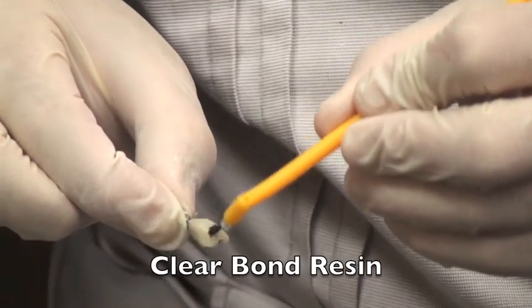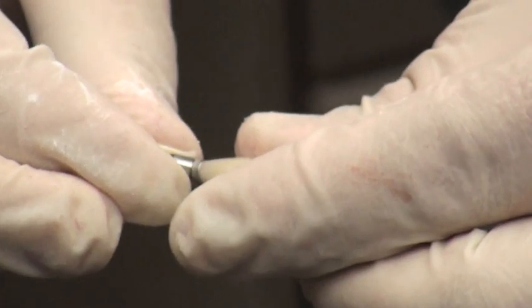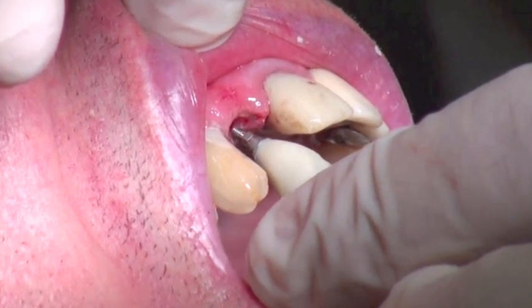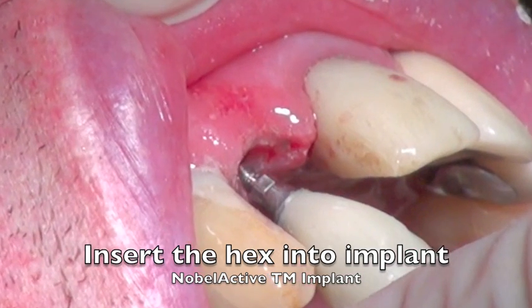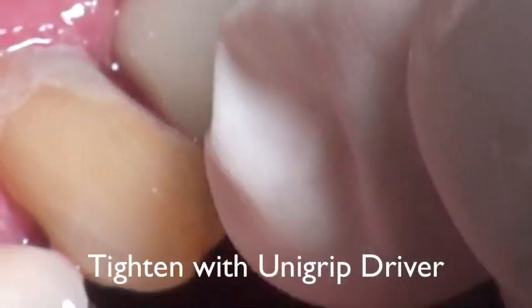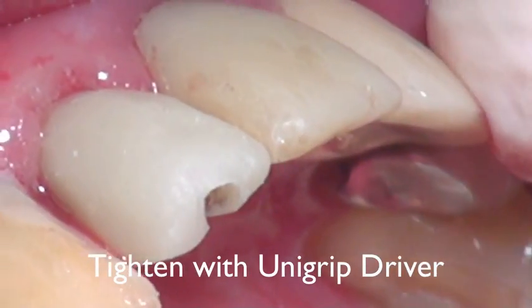We polish it with some discs, make it smooth, and then use a little bit of clear bond and sometimes some stain to make the tooth look nice and match up with the other teeth in the area. I use a replica to do this — take the replica and screw the implant crown down on top. Once it's all finished, we take it to the mouth and have to line up the abutment the same way you would line up the final crown — it is screw-retained and fits inside. As you see here in slow motion, we take the crown and insert it until we find that hex. We confirm this with the anatomy and the occlusion, making sure it is sitting in properly, and then tighten it down. You can confirm seating by the occlusion as it sat from the original wax-up, or take an x-ray if you feel uncomfortable.